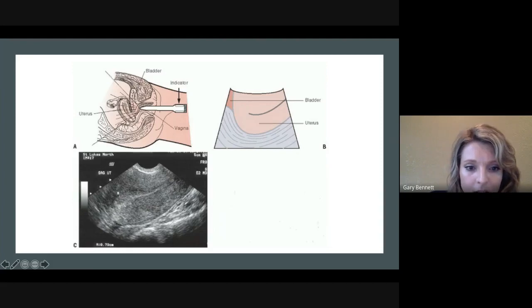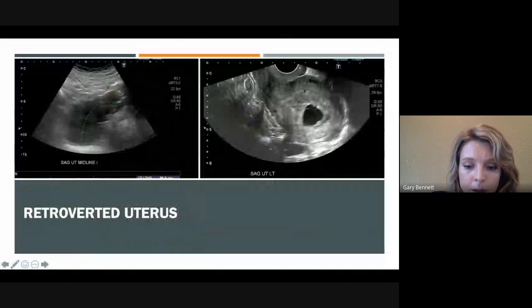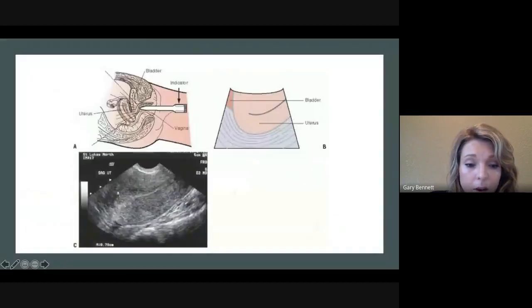But just so that your eyes see that, here's our nice endometrial stripe. Of course, this is also just a pelvic patient that's not pregnant, so just a little bit of fluid is really not abnormal, but just so you see it there.